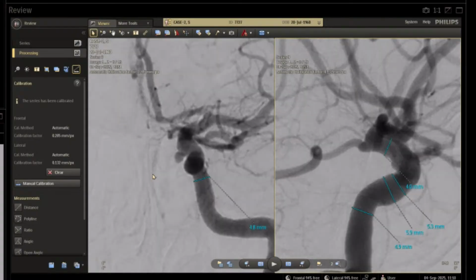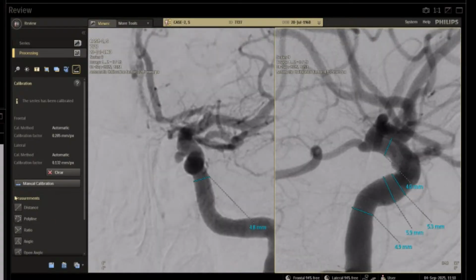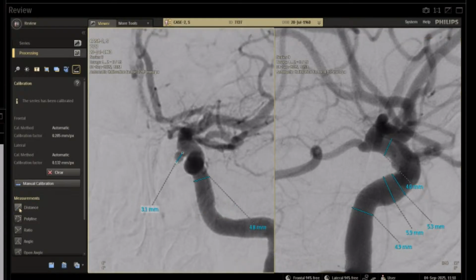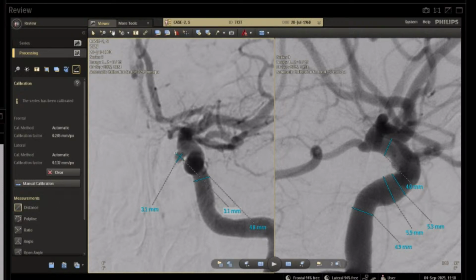Okay, maybe we'll place a LEO Plus stent with a couple of coils. It's also a possible option. This is 3 millimeter, 2.8. Okay, let's see which will be better. Yes, the patient has headaches, that's why the MR was done. It's an incidental finding of the aneurysms.